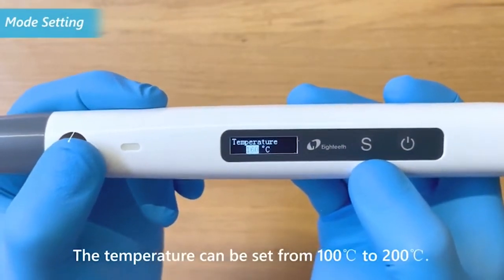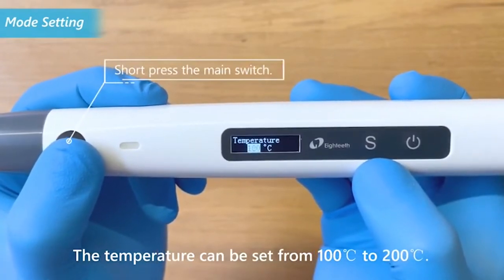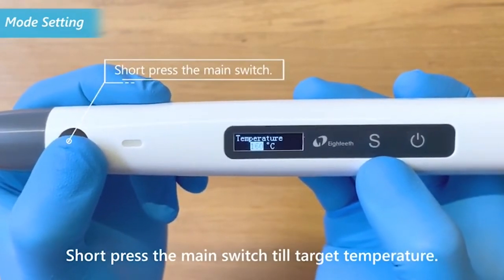The temperature can be set from 100 degrees Celsius to 200 degrees Celsius. Short press the main switch until the target temperature is reached.